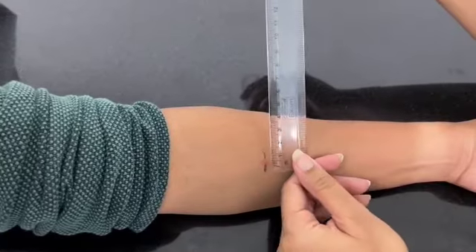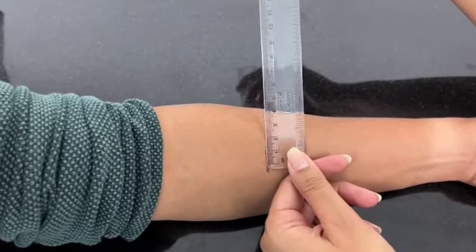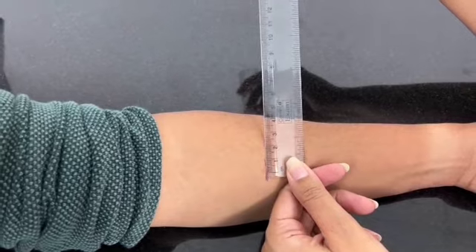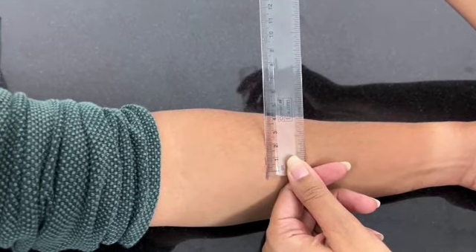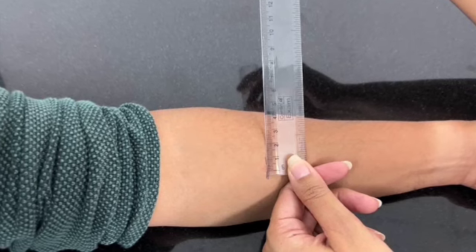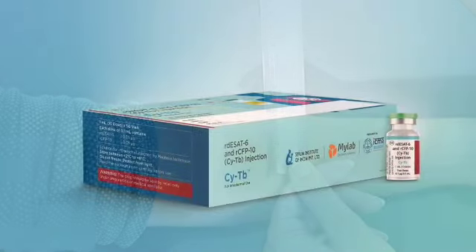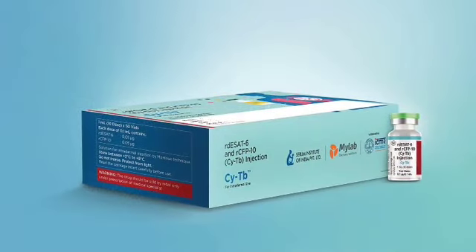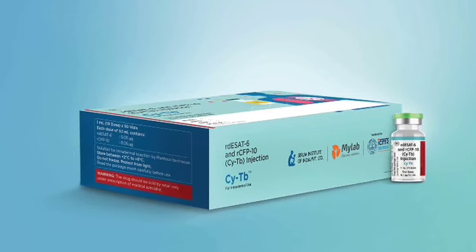Record results in mm of induration with size greater than or equal to 5 mm considered as positive for TB infection. 5 mm cutoff is universal for cyTB skin test irrespective of age, BCG vaccination and HIV status. Accurate and reliable detection of TB by cyTB is an important tool for disease control and tuberculosis management.